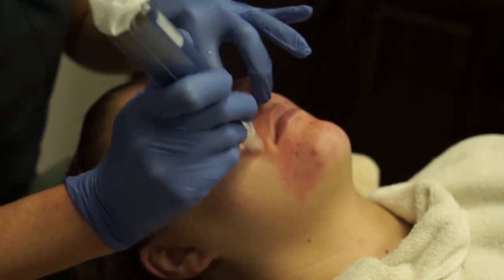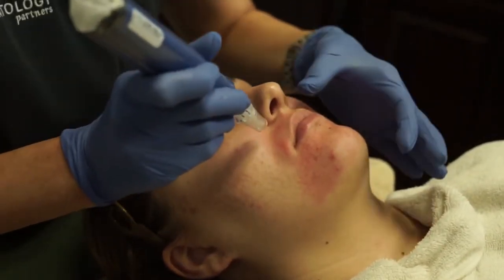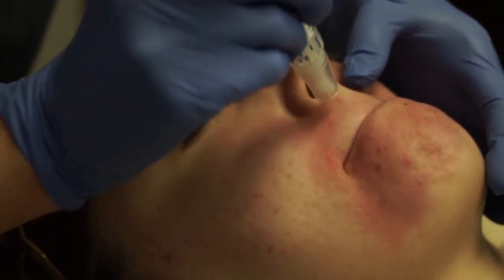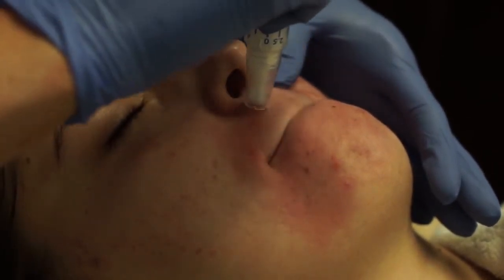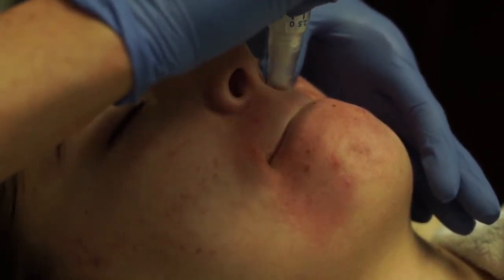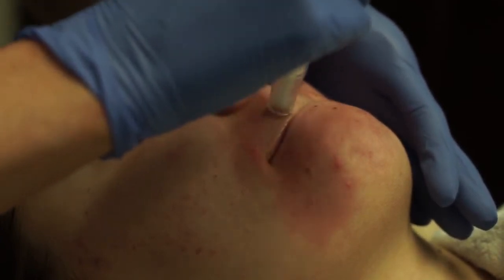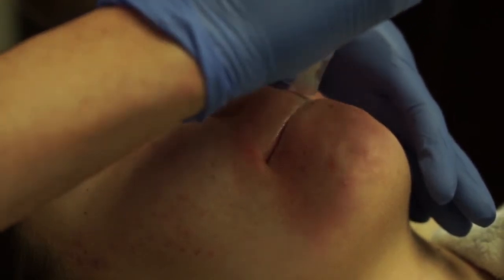As you move to the upper lip, consider smaller, shorter, one-directional strokes. You may ask the patient to press their lips together to stretch and firm up the treatment area under the nose, above the lip. This is especially helpful for patients with a strong, protruding Cupid's bow, as that area would be too bumpy to treat if the lips were not pressed.